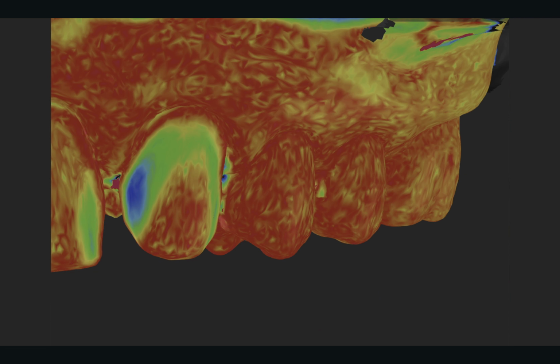and the color won't be right. And once upon a time, you would then have to wait to get the patient back in, re-prep, take another impression. The patient's upset, you look incompetent, you're wasting chair time that's valuable, and you're also wasting the lab's time. Or you'd have a disagreement with the lab and say, oh, just make it work, my prep's fine. There's nothing more humbling than when you start reviewing your own preps, you realize, oh, maybe I didn't do as good of a job as I thought I did. It makes you aware, makes you think.